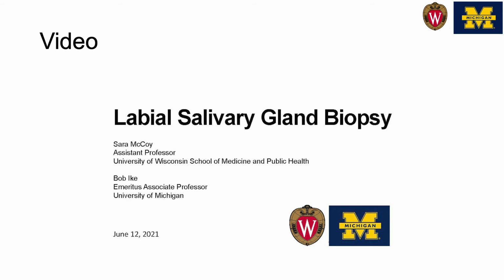First off, positioning. Once you've discussed risks and benefits of the procedure with the patient, it's time to position the patient for the procedure. I usually put them in a chair and stand in front of the patient. I cover them with a gown, draping it over their front before I start the procedure.